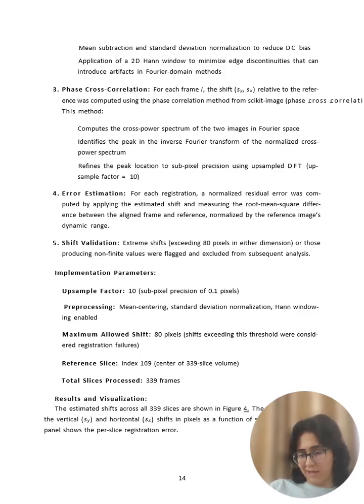We validate whether there are extreme shifts, and we can consider them as outliers, or we need to consider them as jitter. The implementation parameters are further discussed, and then results and visualizations are also shown.